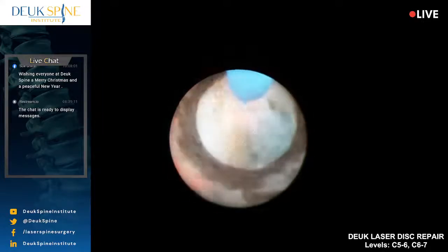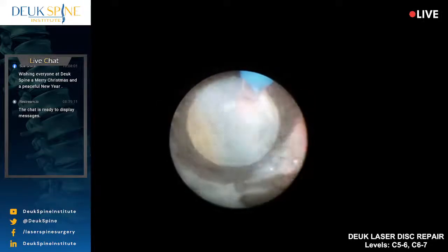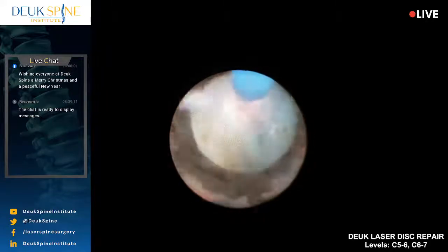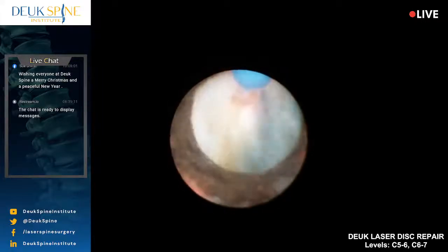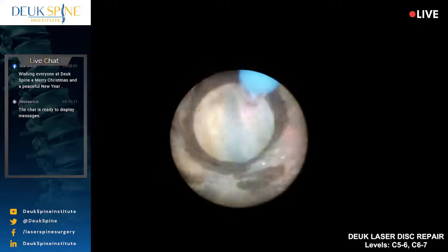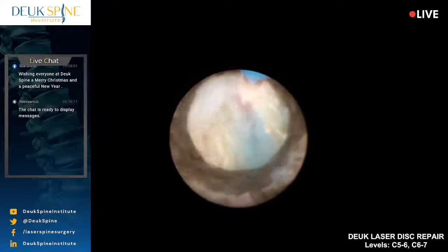All right, so what I'm dealing with here is the tear in the back of the disc, and I'm cleaning up the edges of the tear. It's called an annular debridement. This is the most important part of the surgery. You cannot just go for a herniation and be done if you want to get rid of the neck pain and you want the patient's disc to stop degenerating. You have to get the annular tear cleaned up.